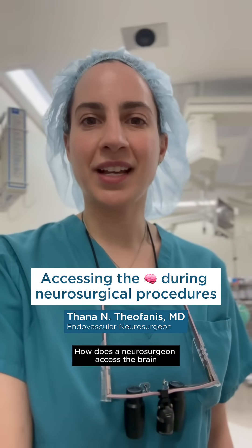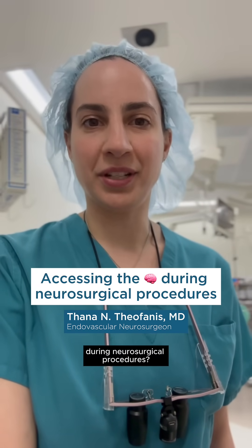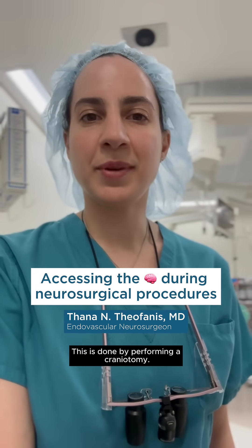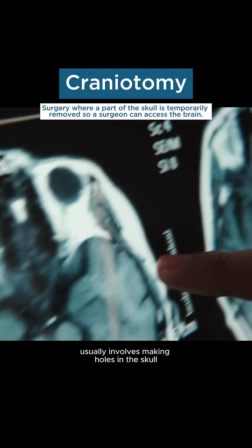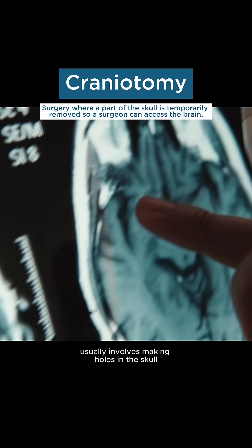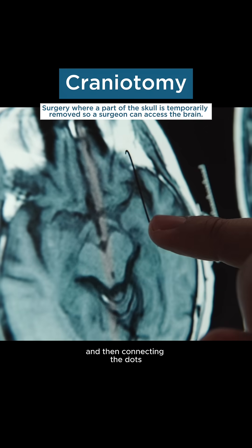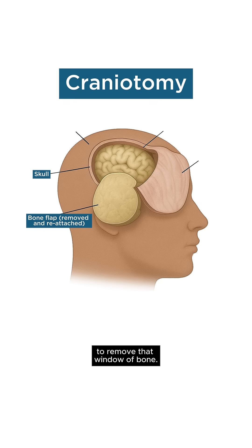How does a neurosurgeon access the brain during neurosurgical procedures? This is done by performing a craniotomy. The first step usually involves making holes in the skull and then connecting the dots to remove that window of bone.